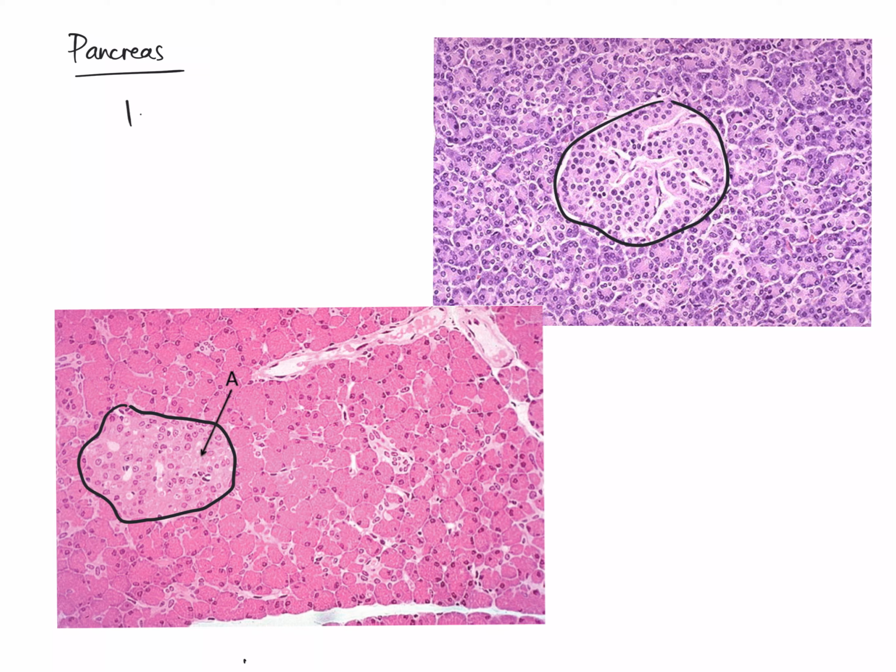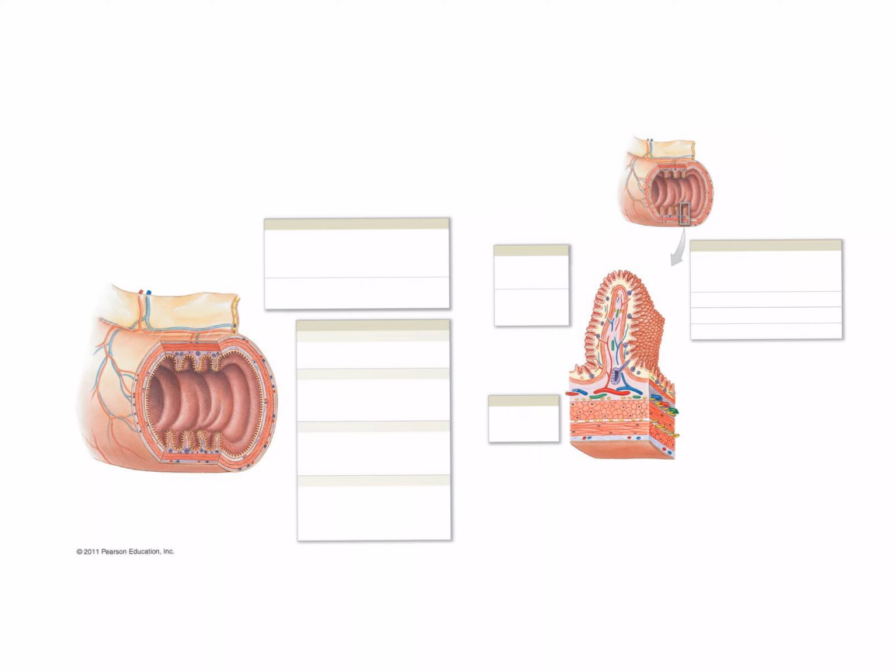When looking at the gastrointestinal tract, what we want you to be able to do at this year level, and in more detail in your coming year levels, is identify, just by looking at the identifying features, maybe anatomically or histologically, the segment of the tract that you're looking at. So let's identify some of those key features that are present throughout the gastrointestinal tract.